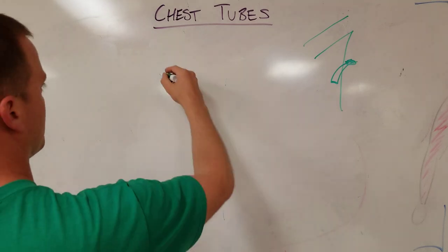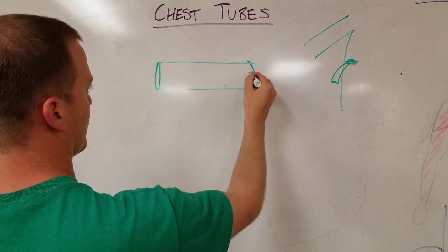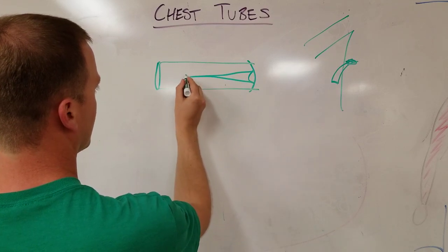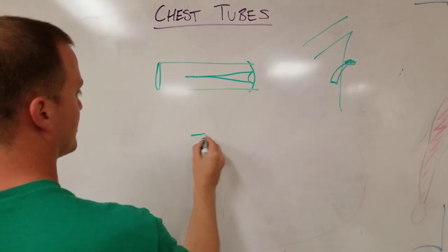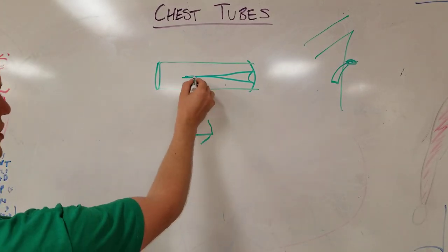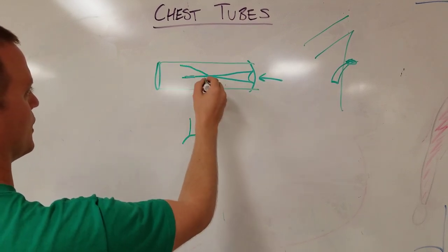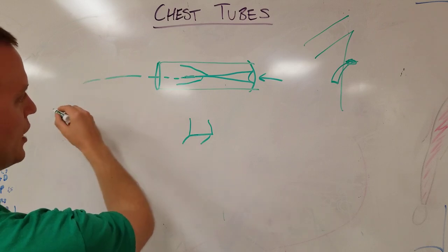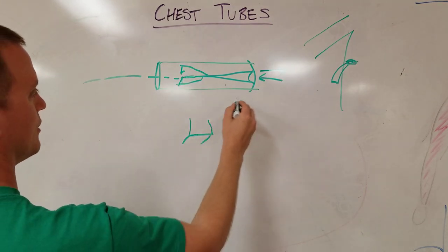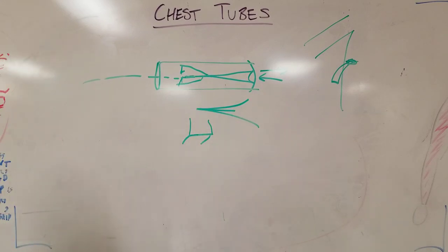So one thing you can hook this up to is a one-way valve. Classically or historically, that can be what's called a Heimlich valve. Now, a Heimlich valve is a piece of plastic that has a slit in it, and it gets bigger. And so what happens is this slit, if air was to be forced this way, this would open up, it would flutter open, and air would be able to go out. But if the patient sucked in, these two flaps would close back down together, making this type of contraption again. So that's a Heimlich valve or a one-way valve.